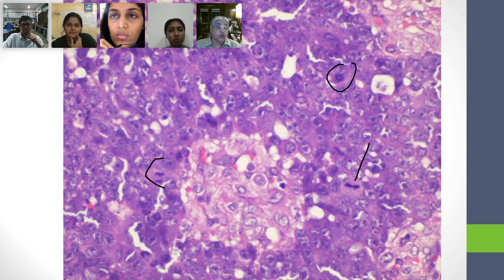It's not there. Okay. Neha, where is the nuclear membrane gone? It's involved in the process of mitosis. What does that mean? Neelam? Like the chromatin material.